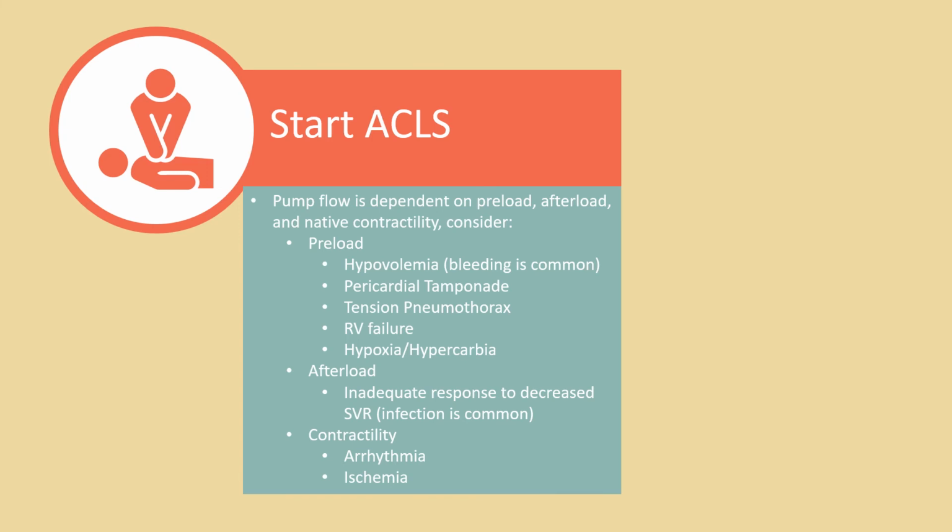The VAD does adapt to changes in loading conditions to a small degree, but not enough to compensate for these big changes in SVR. So someone who's in septic shock may manifest in a much more severe way because the VAD can't increase cardiac output adequately. It relies on somebody changing the RPMs up or down. So if nobody changes those RPMs, your cardiac output will stay at what it was for normal physiologic conditions. So it's important to consider that sepsis or some other cause of decreased SVR could manifest very dramatically.